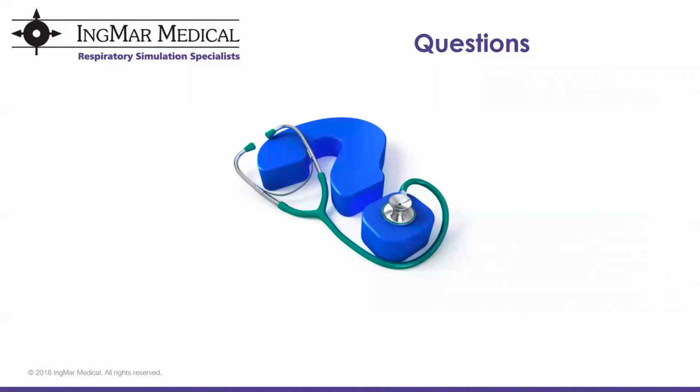And a lot of our users do use the system that way. I mentioned that interactive approach where you really only need those breath patterns interacting with the ventilator to show some very important concepts. But the scenarios, like we had demonstrated for you today, are much more comprehensive than that in that they include these other assessments, the case description, the recommended ventilator settings, etc. And for that, we have about 45 individual modules that cover some of the topics that I just gave an overview of.